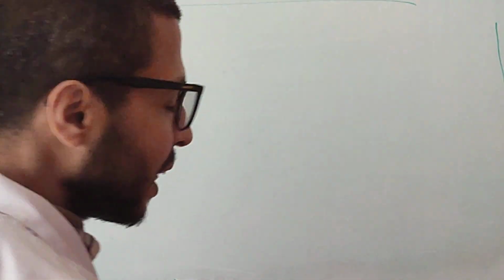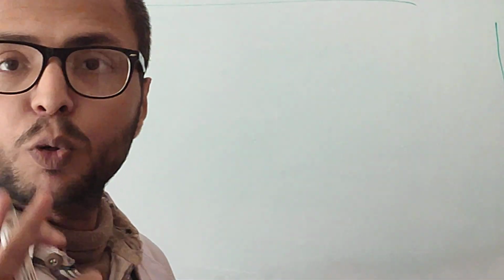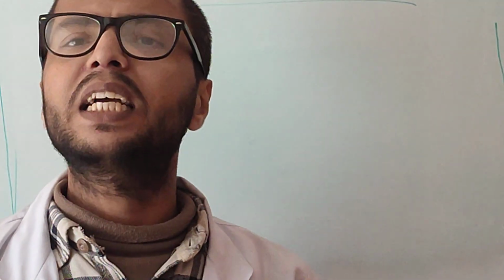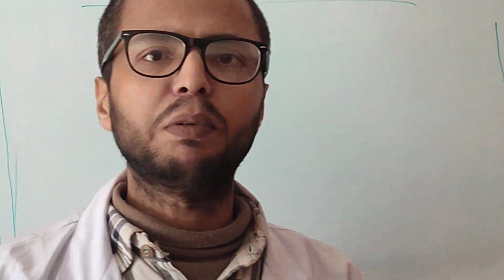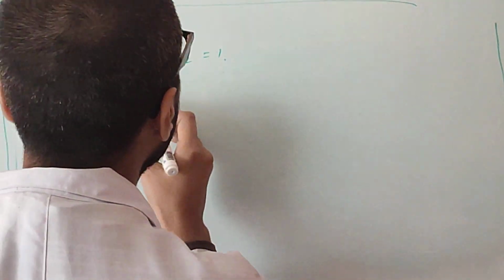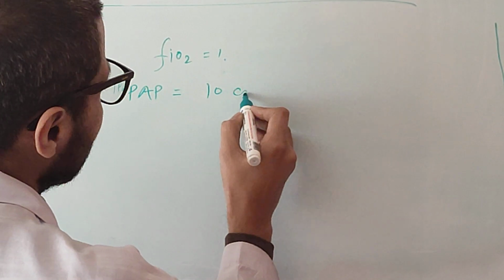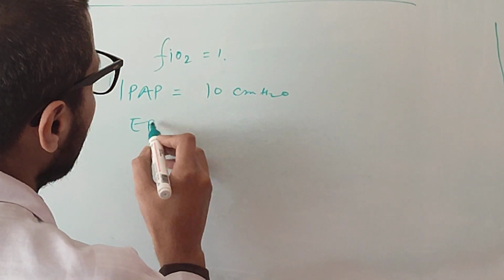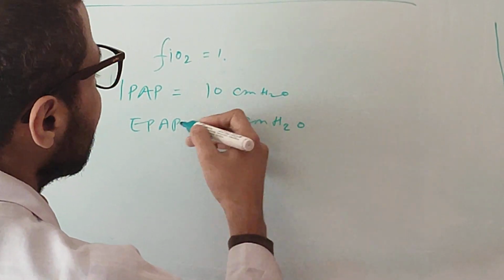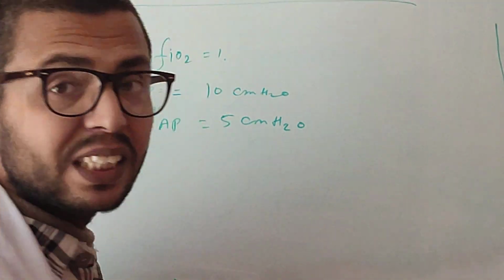Okay. So after that, let's come to our patient. So I was telling how to do setting in NIV. What I told you is that you set initially FiO2 100%, and in that you have to keep IPAP. So initially we keep IPAP at 10 centimeter water and EPAP at 4 to 5 centimeter water. Initially, and we increase or adjust this based on the clinical status of the patients and ABG status of the patients.